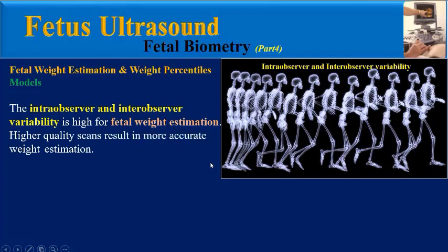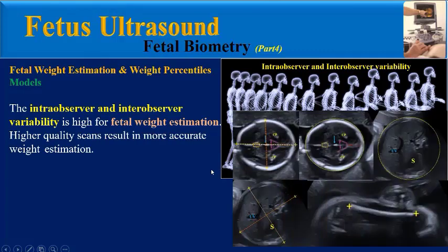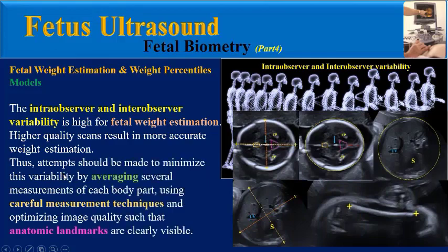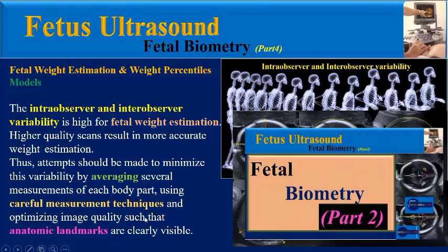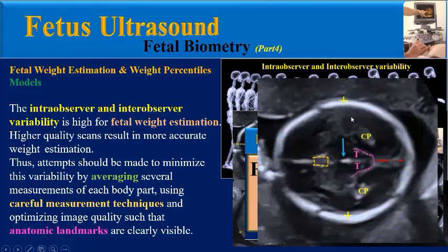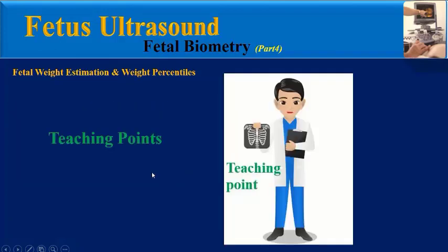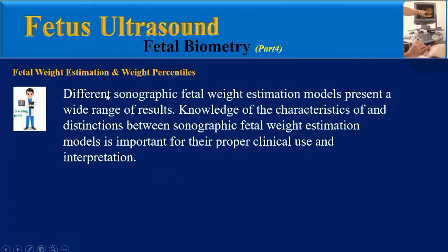Higher quality scans result in more accurate weight estimation. Attempts should be made to minimize variability by averaging several measurements of each body part, using careful measurement techniques as explained in video Part 2, and optimizing image quality such that anatomic landmarks are clearly visible.